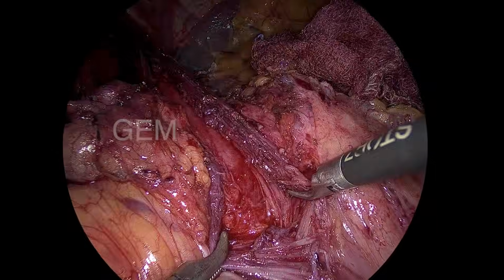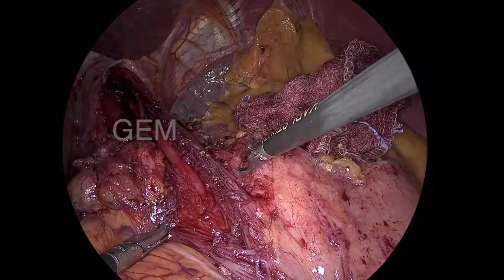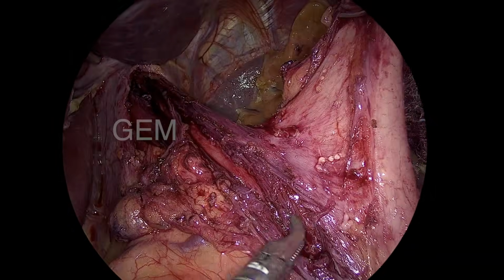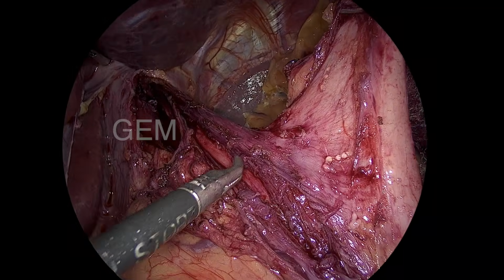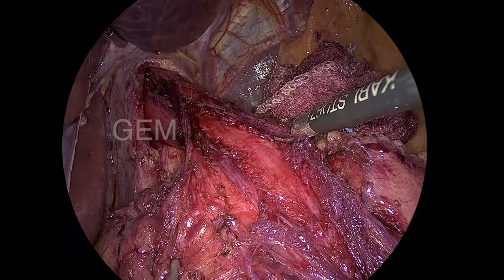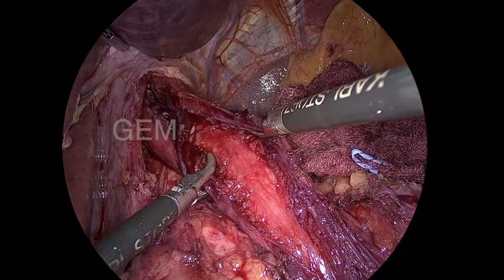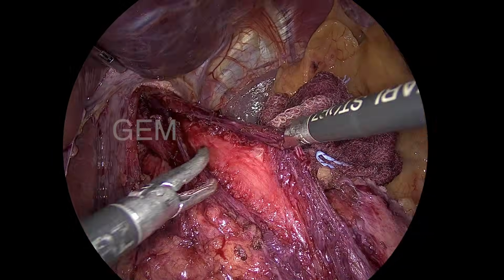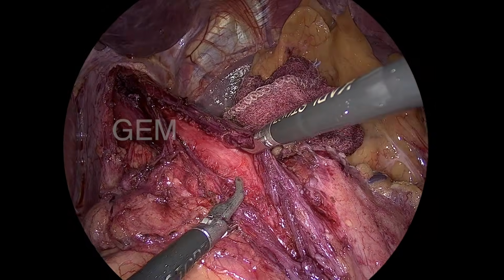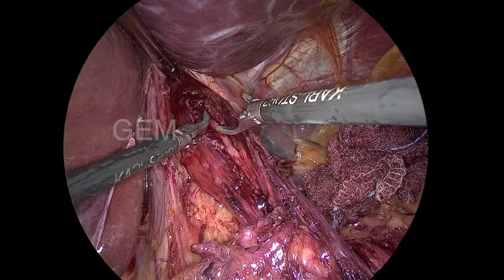So, slowly you have to do it, patiently, but do not fear mucosal injury; that is very rare. Unless you make some dissecting movement with the Maryland and try to separate the muscle by a dissection technique, then you will injure the mucosa. Otherwise, you can see it is very easy. It took around 10 minutes or maximum 15 minutes to do the myotomy. Even though I am doing it very slowly, it takes only that much time, and it's almost an unedited video.